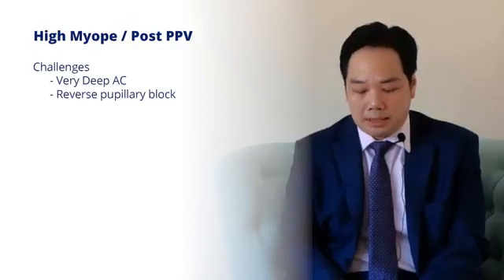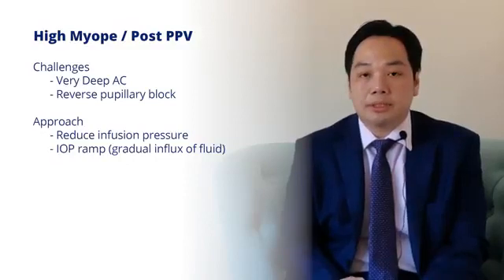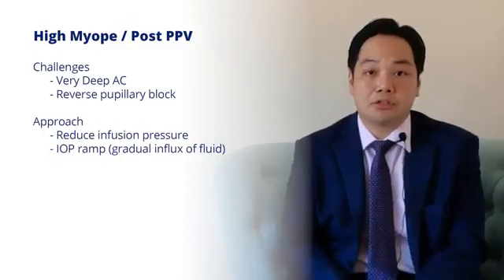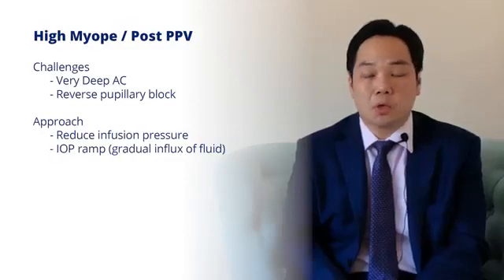In the high myopes and post-vitrectomized eyes, you have a different challenge now, because you have a very big eye in a high myope, or no vitreous support in a post-vitrectomized eye, so you end up with very deep anterior chambers, and often you get lens iris diaphragm retropulsion syndrome or reverse pupillary block. So the approach again is not to inflate the eye quickly, because in these eyes, when you get a reverse pupillary block, it can cause quite some discomfort to the patient as the iris gets stretched. So the approach is to reduce the infusion pressure and do everything slow-mo as well.